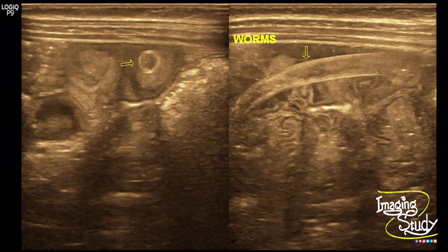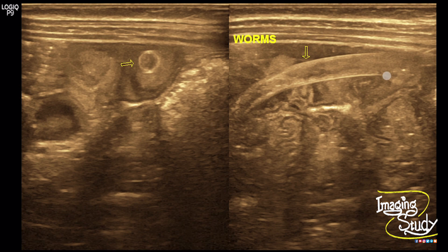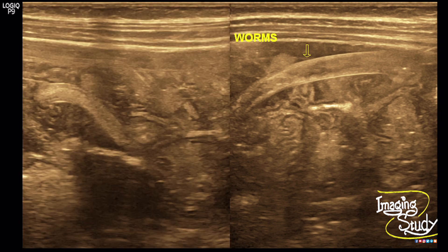Here is the picture of the Ascaris lumbricoides in longitudinal and transverse section. In transverse section it forms a round shape, and in longitudinal section it appears as an echogenic linear tubular structure. These are live worms within the small intestinal lumen.